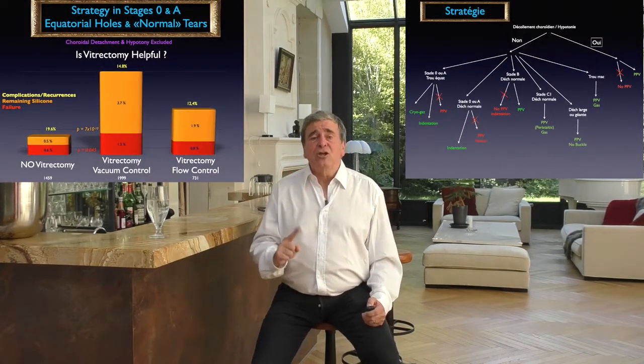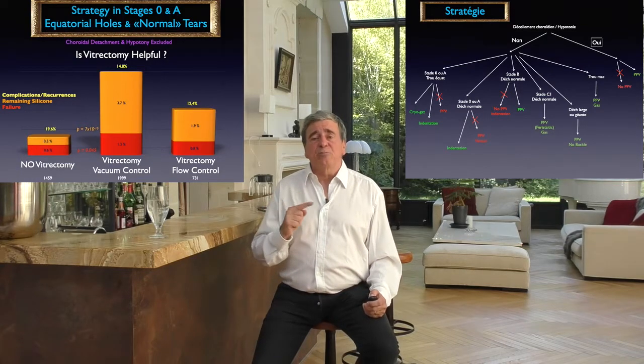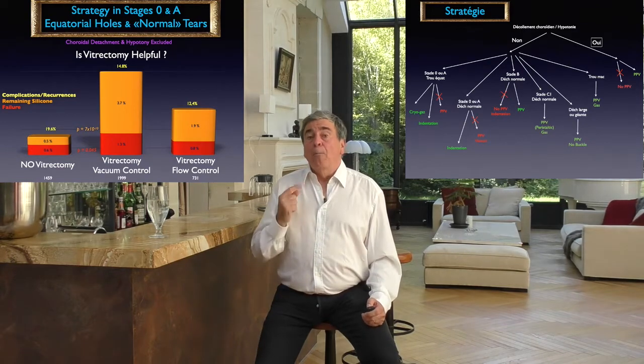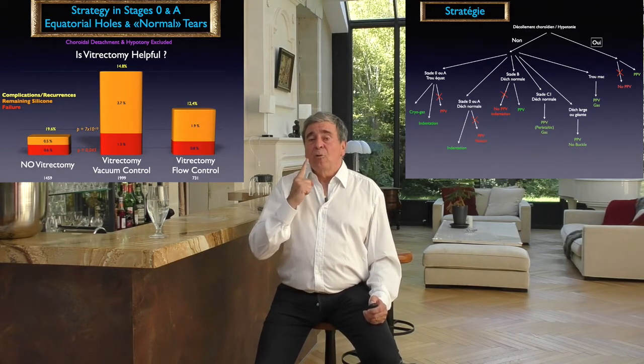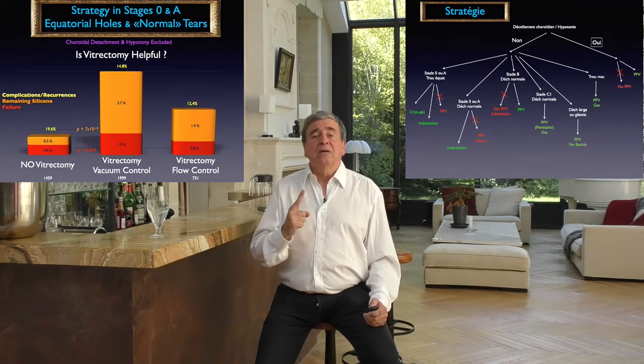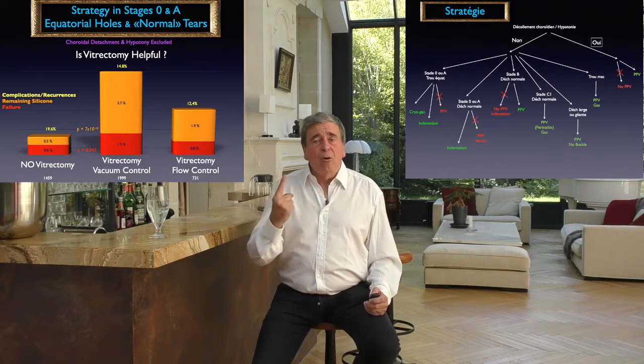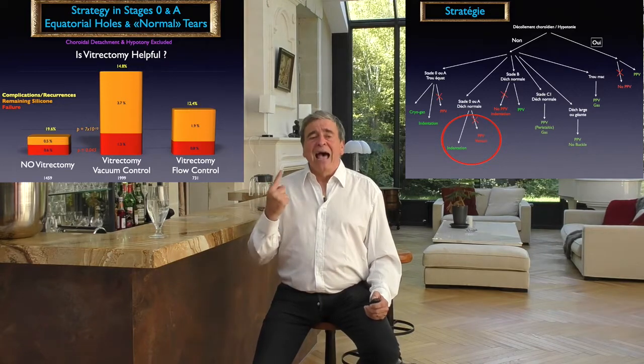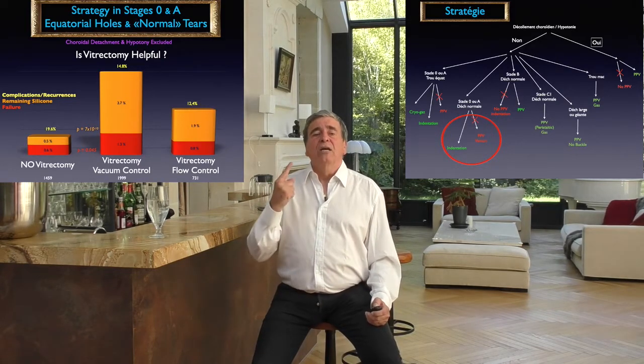The complication rate for a machine equipped with an aspiration flow control will be acceptable, but for a machine equipped with a venturi pump, the complication rate will not be acceptable. The surgeon then has to switch to an indentation.